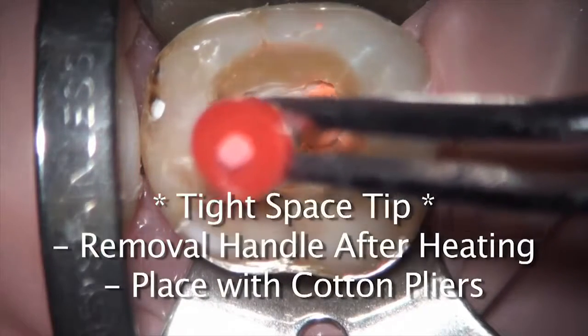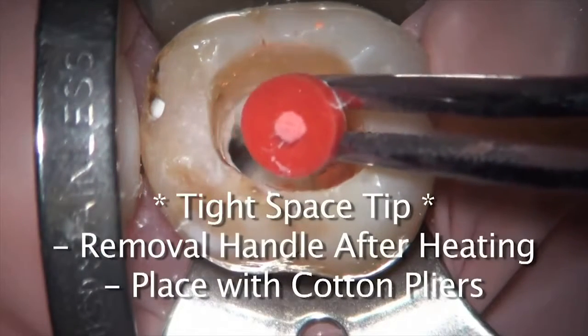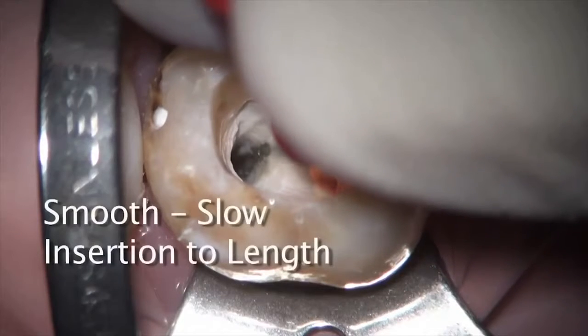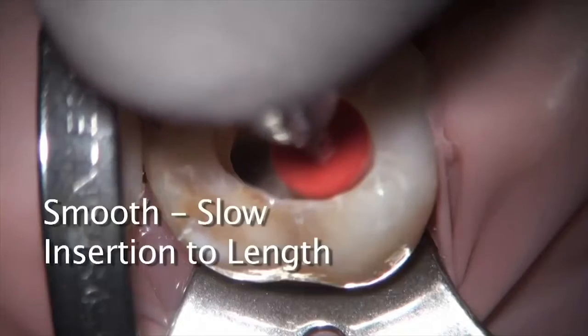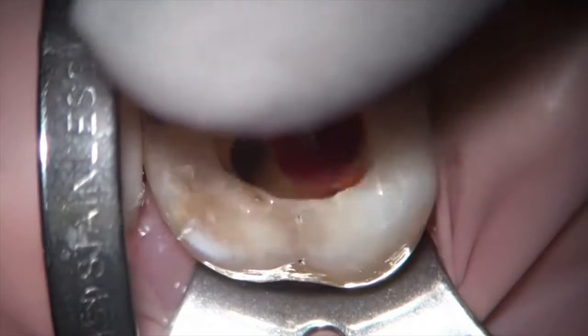The ability to break off the handle of the GuttaCore is one of the beauties of this system. Doing so turns the obturator into a short GuttaPercha. This is a huge advantage, especially in teeth that are difficult to access, such as posteriors. If you wish to keep the handle in place, then you may do so, but I don't see the benefit of doing so — you'll have much more control using cotton pliers than your fingers. Also, while obturating, please do not turn the obturator as if you're placing a file into the canal. It should simply be placed in an inward direction into the canal.